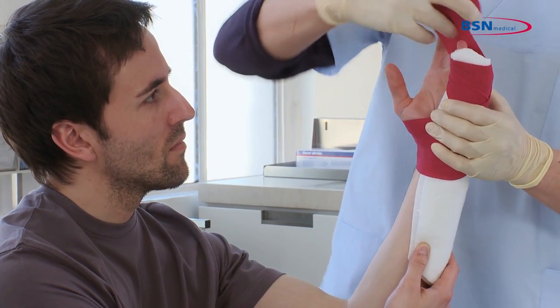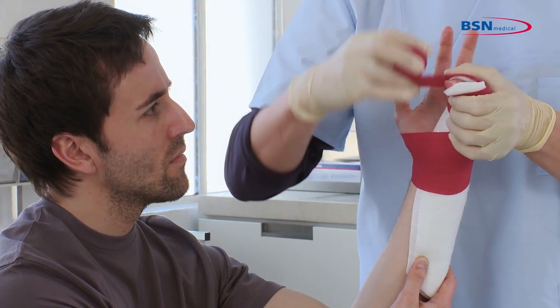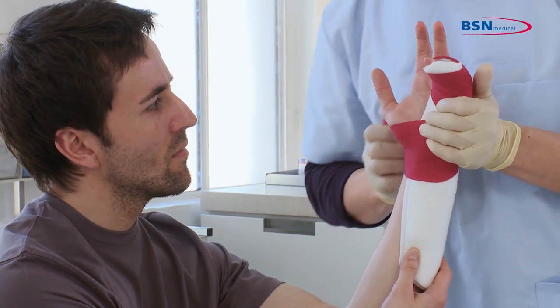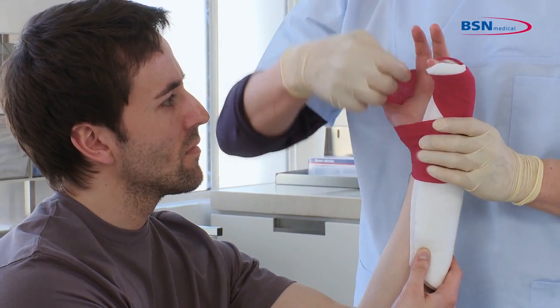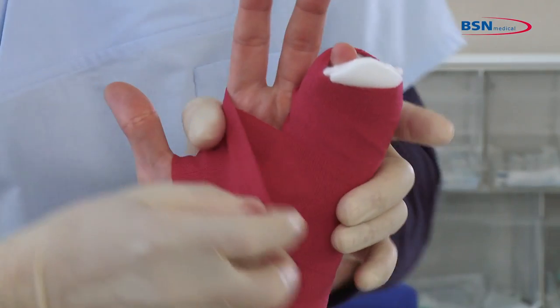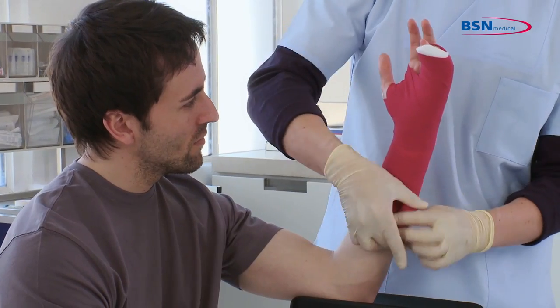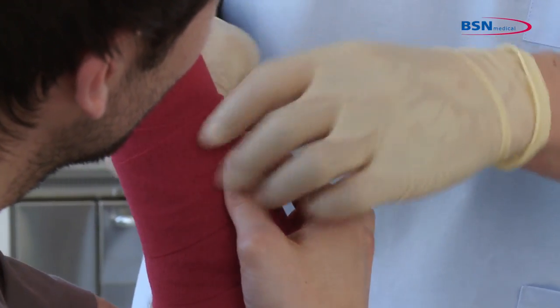Repeat this step again and position the two fingers at the right angle. Continue wrapping through the web space and work distal to proximal down the arm by overlapping 50% of the bandage. At the end, fixate the bandage with tape or a hook and loop fastener.